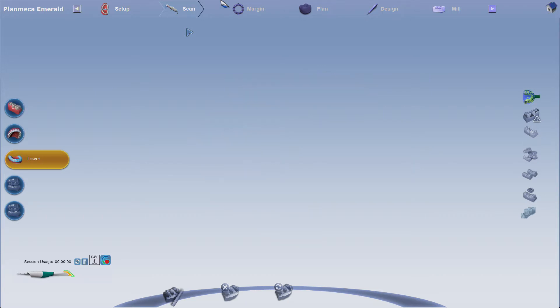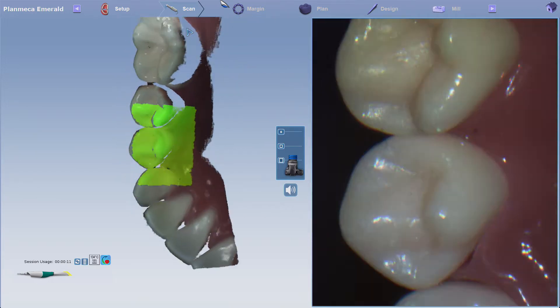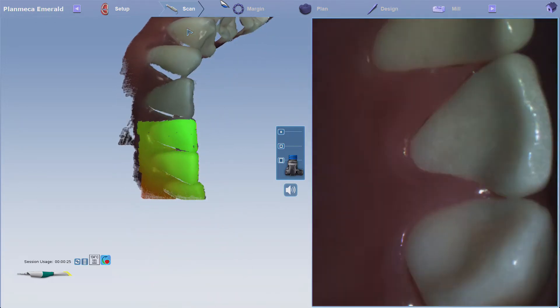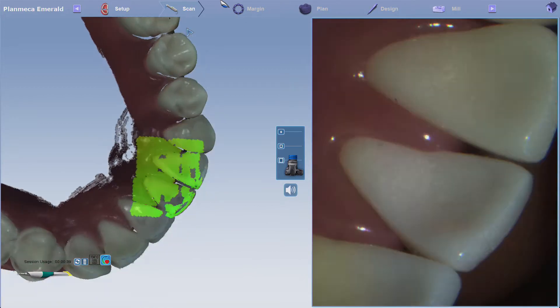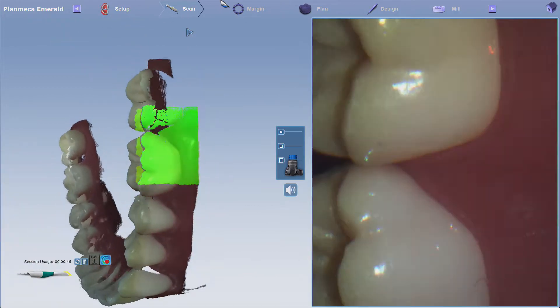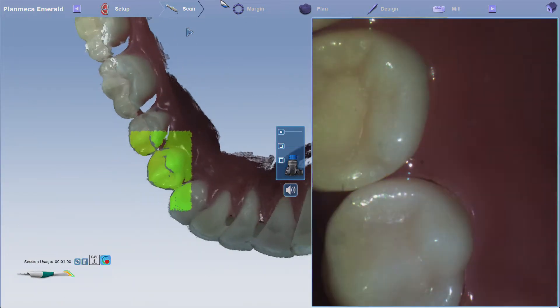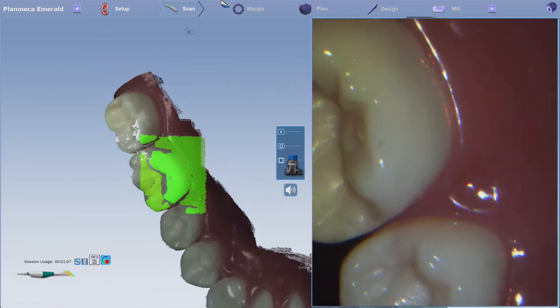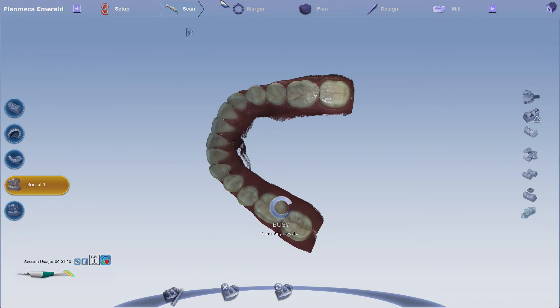Scan the opposing arch in the same pattern: occlusal, lingual, buccal. Then you'll flip and scan the occlusal, lingual, then buccal. Fill in where needed. Continue to the next scan by clicking the bottom button of the scanner.